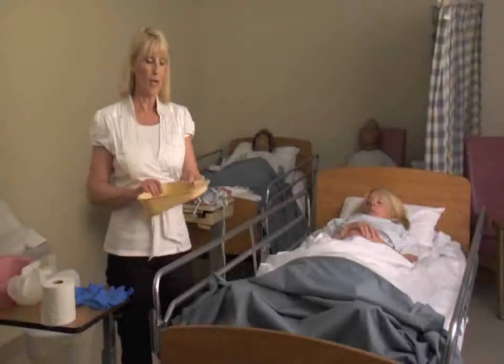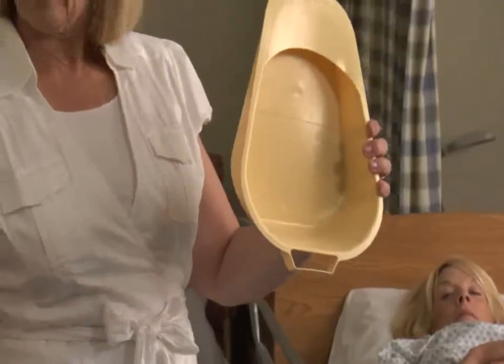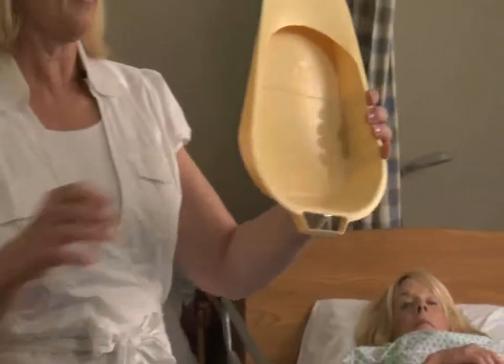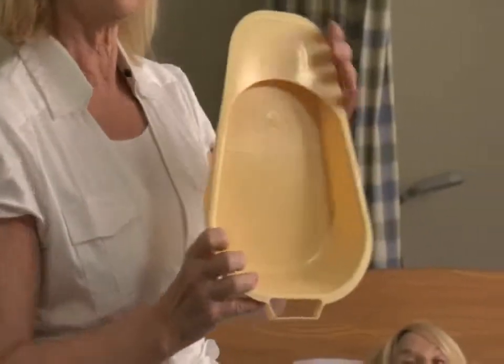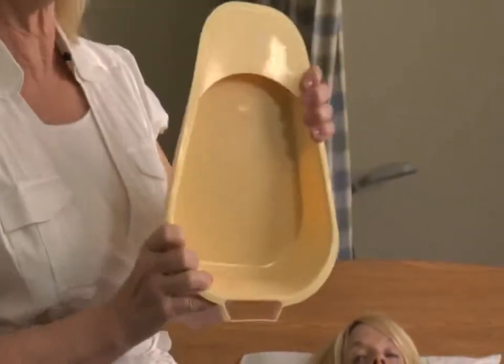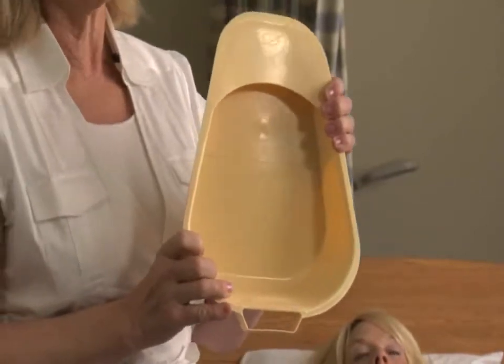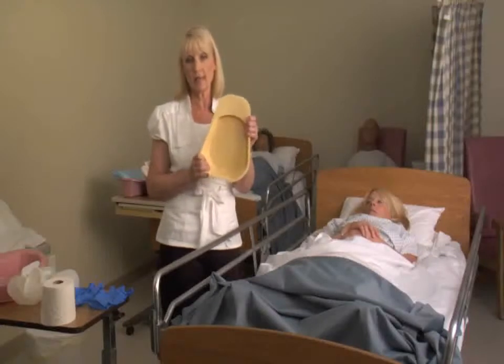I'm going to show you how to use both kinds of bedpans. We have the fracture pan and we have a regular bedpan. The fracture pan is smaller and it has a little flat part that goes up behind the patient's hips. We use a fracture pan when the patient's had a hip fracture or back surgery or neck surgery — it's for patients who cannot sit up in bed.